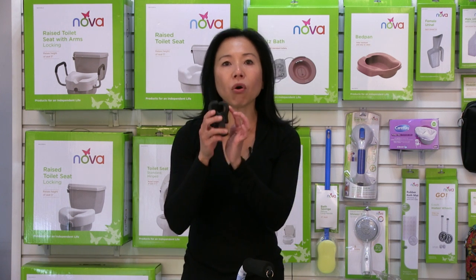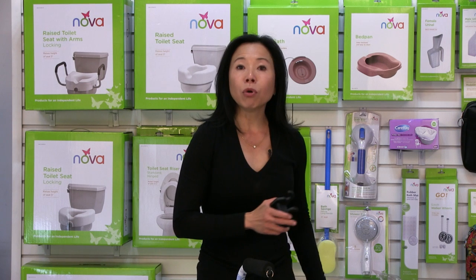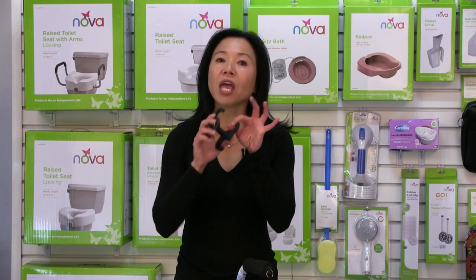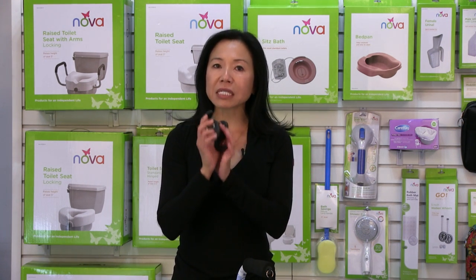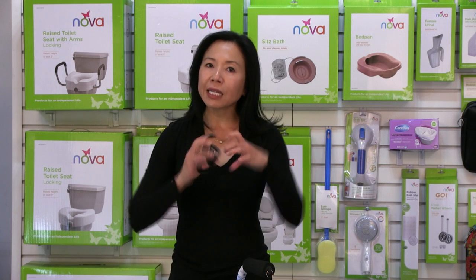The smaller diameter on the other side attaches the cane, and this works only on a seven-eighths inch diameter cane. Most of our straight aluminum canes are that diameter, but for example our folding canes are three-quarter inch diameter — it would not work. So only on a seven-eighths inch diameter cane and a one-inch diameter walker.